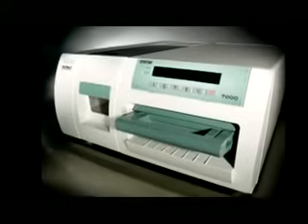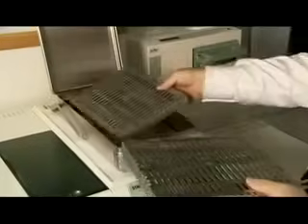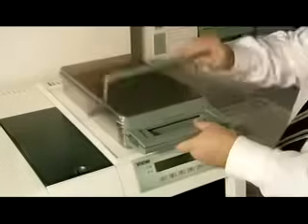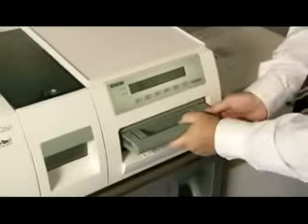Finally, let's look at our largest sterilizer, the Statum 7000 with DryTec S. The Statum 7000 is our newest and largest unit, holding two full-size cassette loads. The DryTec S solution uses superheated steam drying technology, the most advanced technology available in the industry today.